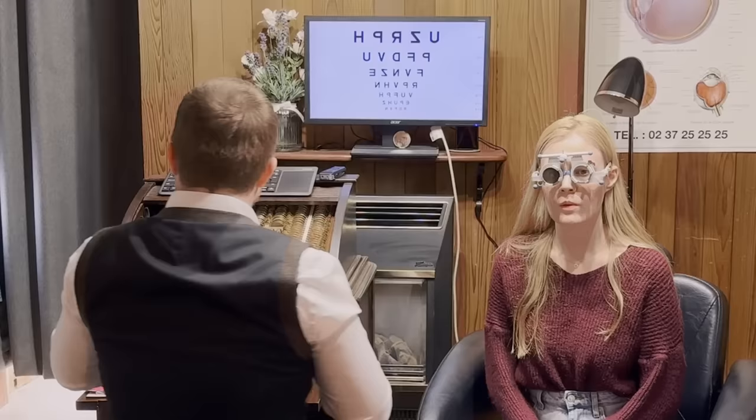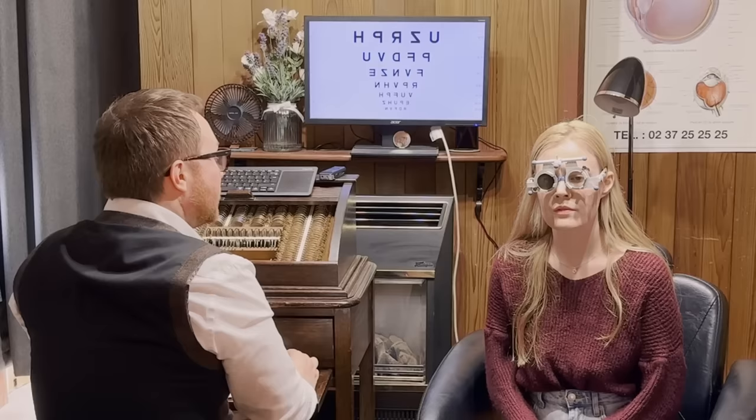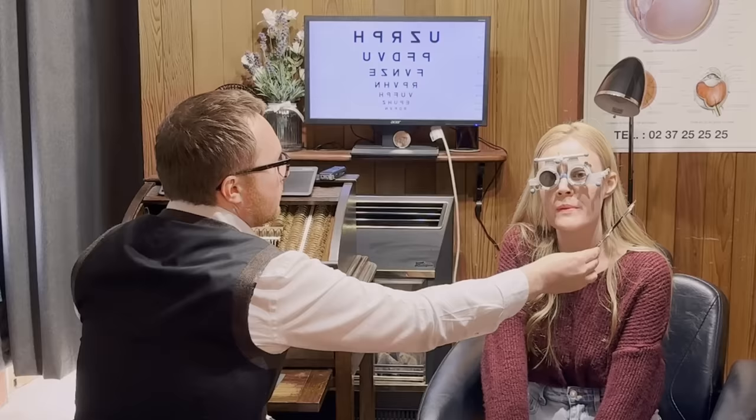Yeah. Can you get anything on the very bottom one at all? Very good. V. Yep. With N. 5 out of 5. Good guess. Brilliant. So looking at the bottom two lines of letters. Now I'm going to put this lens in front. Is it a bit better? Is it a little bit worse? Or about the same? So that's with... It's a bit worse.